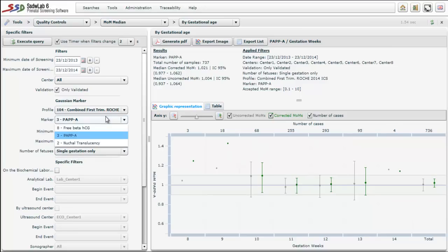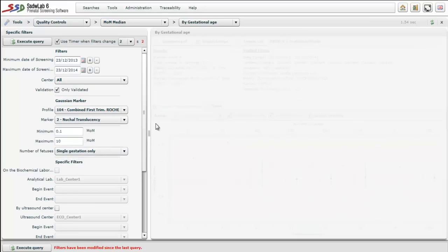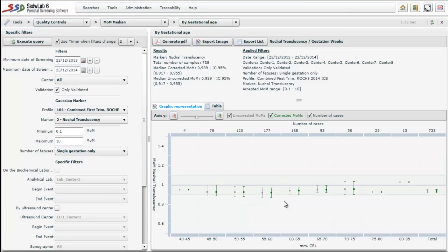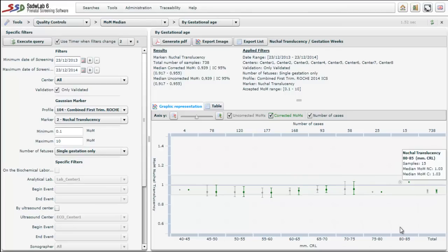For nuchal translucency, the median MoM value is 0.939. At the bottom of the graph, gestational age is measured in fetal length by millimeter intervals. We see that approximately all values are within the range of 10% of 1.